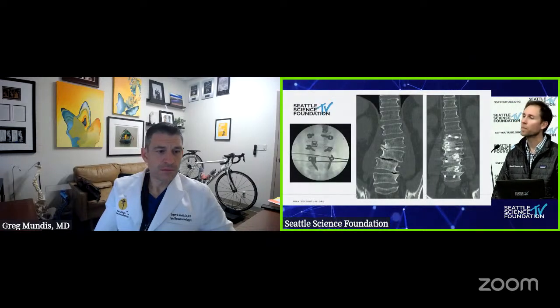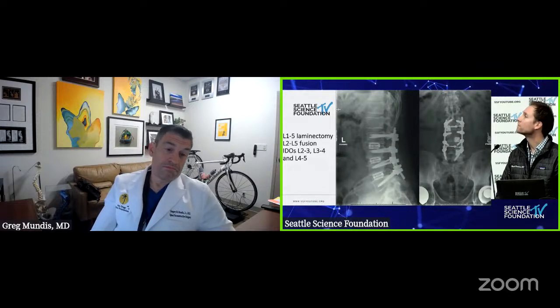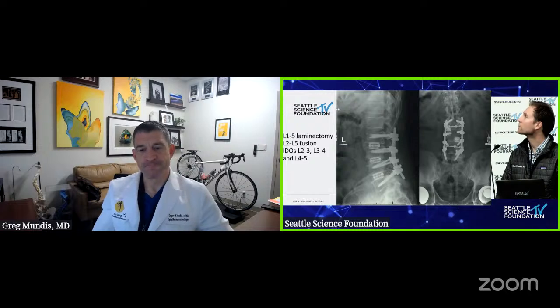Do you think that this is totally insane on my part to just do a very limited fusion with a decompression above this fusion, trying to do midline sparing surgery? Is this bound to fail? Do we have to go to the pelvis if you look at that L5-S1 junction?